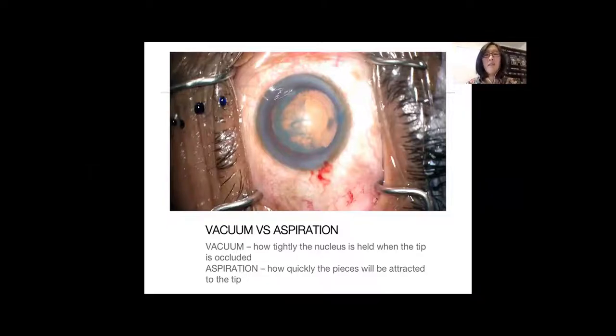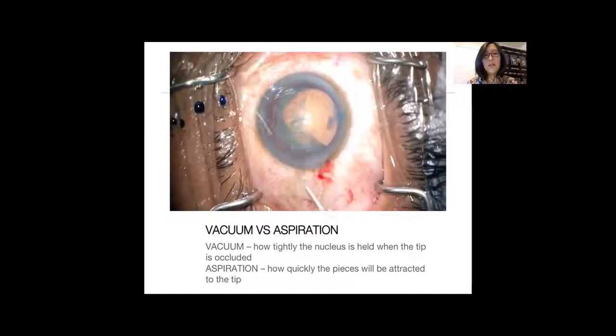Also important is an adjustment of the choice of phaco tip. Sometimes I'll have residents where we've gone to a 45-degree tip, they're not getting full occlusion, and so they're trying to increase their vacuum. My answer to them is let's change back to a 30-degree tip, and make sure you have full occlusion before we go ahead and make that change. And so let's see here.